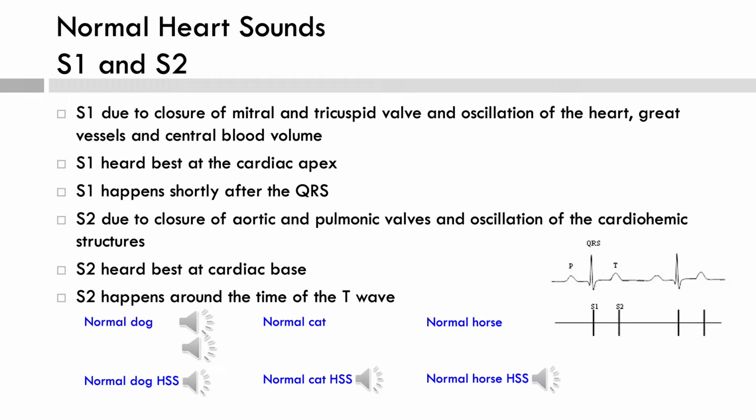And next, let's listen to the heart sound simulator trying to mimic a horse heart rate. The heart rate is slow. And finally, we'll listen to the heart sound simulator's attempt to make cat heart sounds. The sounds are a little too tympanic and they last too long for a cat, but the faster heart rate gives you a feel of how fast a cat heart might beat.